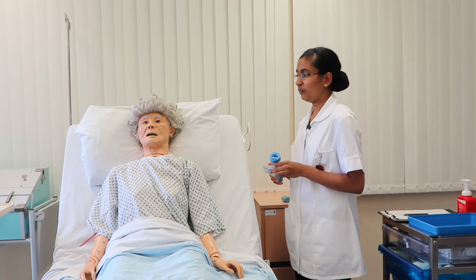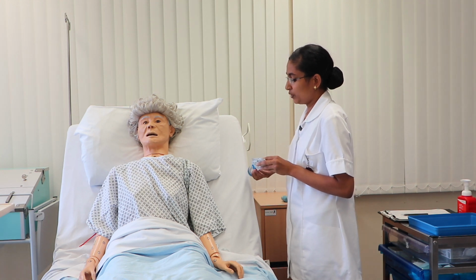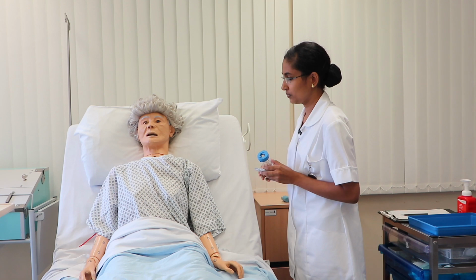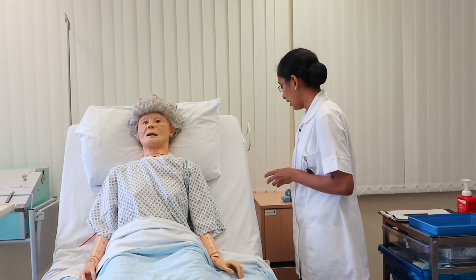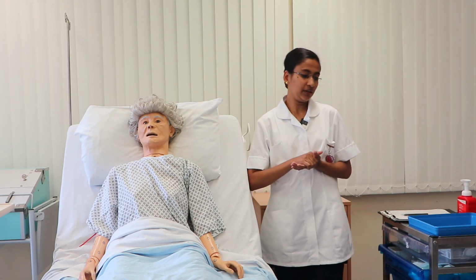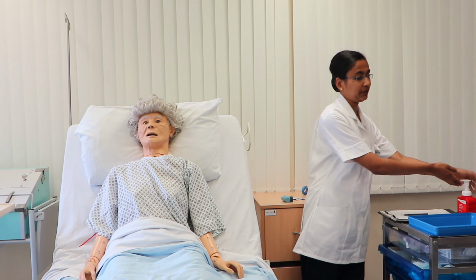Okay, Bob, now I am leaving this aero chamber at your bedside. When you are using it, and after using it, you have to wipe it with this alcohol wipe. Is that all right for you? Okay, now I am going for my aftercare and final documentation. Is that all right? Okay, so the tray will be disinfected for the next use, and I will do my final hand washing and final documentation.